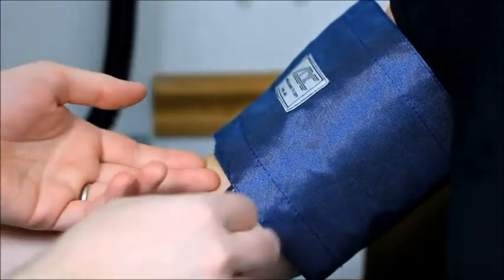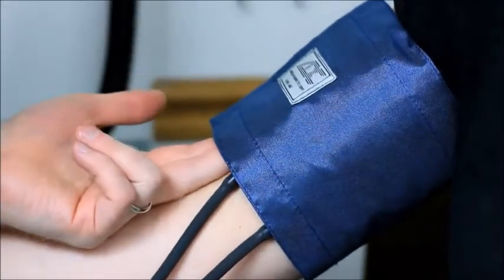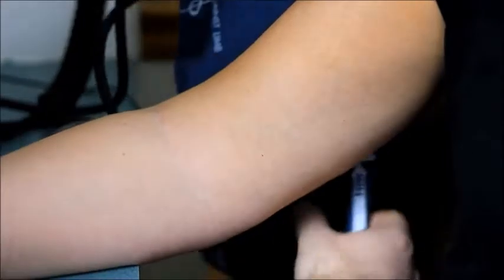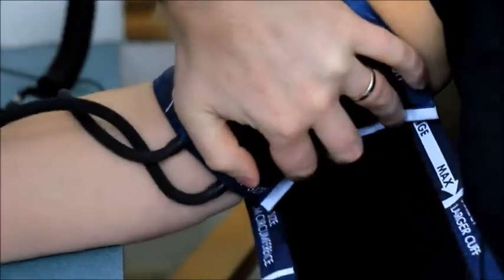The cuff should be applied 2 centimeters above the crease of the elbow. It should fit snugly but still allow two finger widths under the cuff. When the cuff is in place on the upper arm, the index line should fall within the range line.